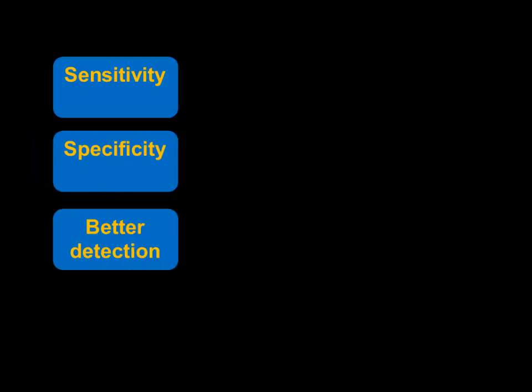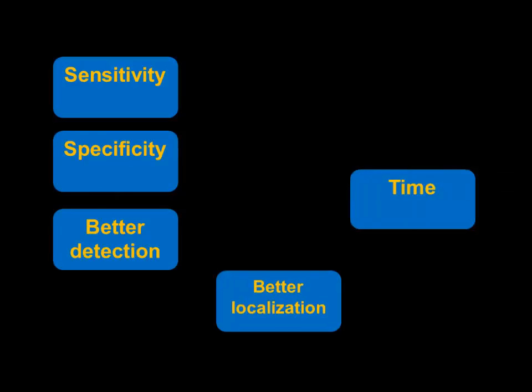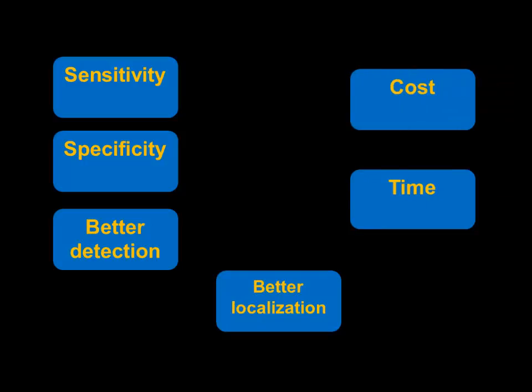Again, doing the SPECT CT, because all these patients are very complex, they have had all these imaging, but if you do a SPECT CT as a one-stop, it improves the sensitivity, specificity, better detection, better localization, shorter time, you get a one-stop service, and the cost implications are less.